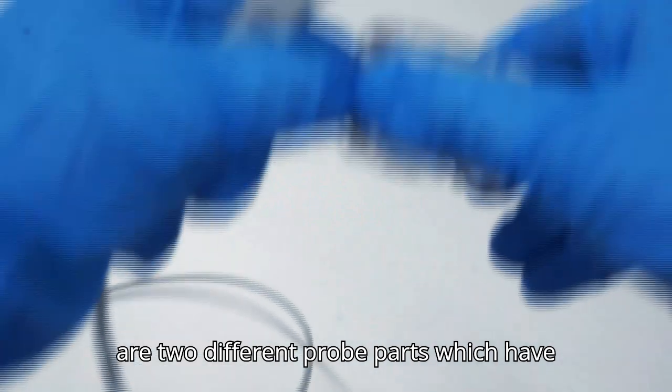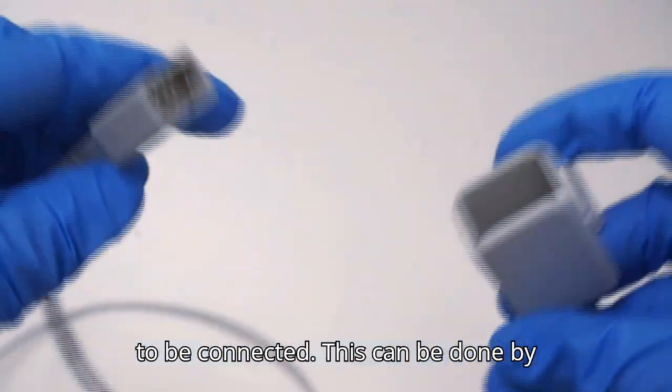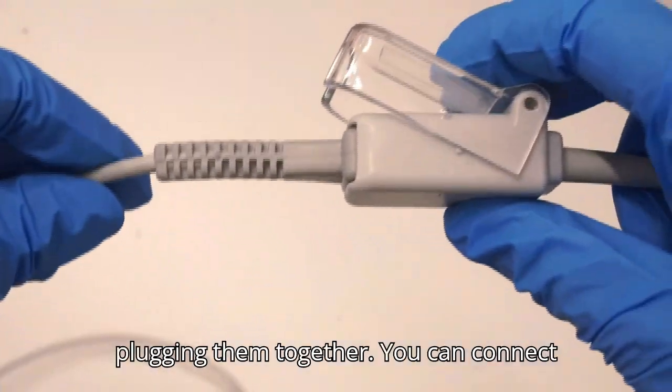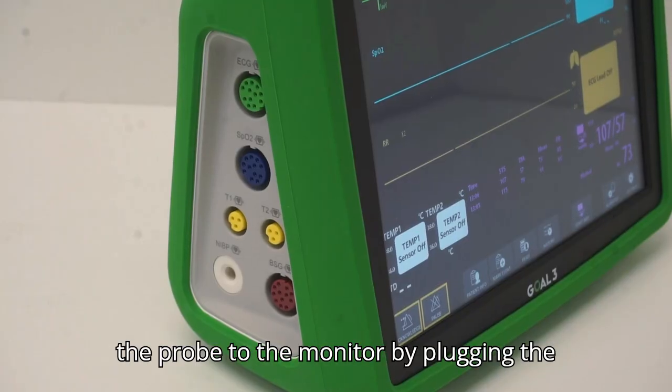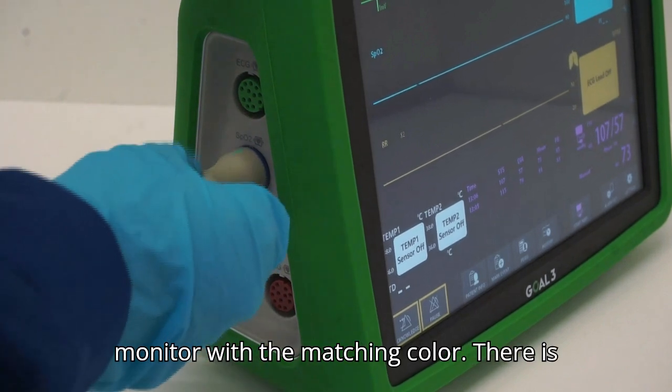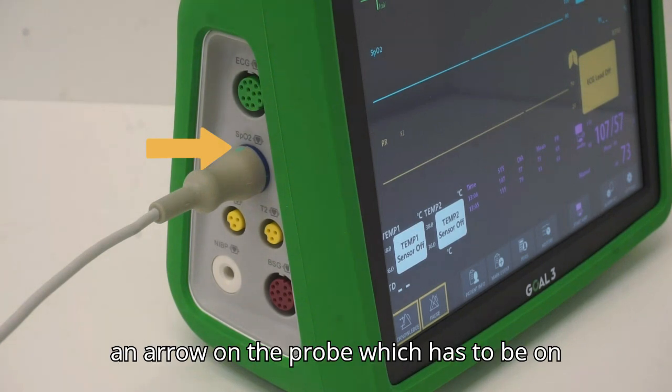There are 2 different probe parts which have to be connected. This can be done by lifting the clear shutter and then plugging them together. You can connect the probe to the monitor by plugging the probe in the port at the side of the monitor with the matching color. There is an arrow on the probe which has to be on the top.